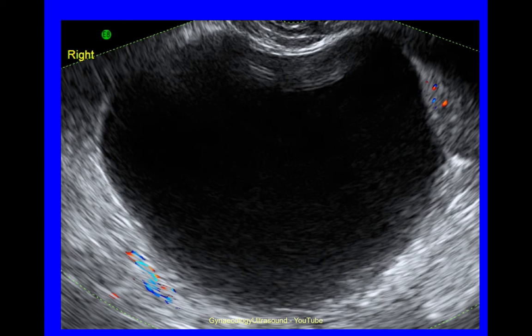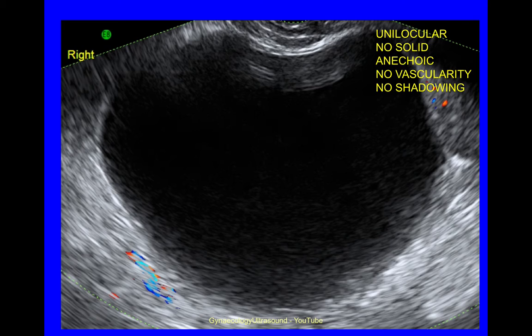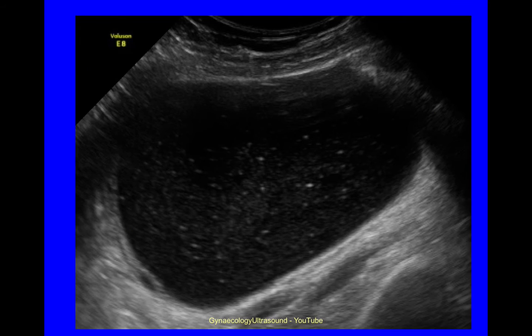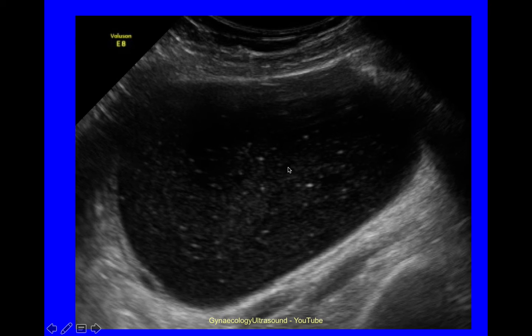Another large cyst at 105mm — unilocular, no solid material, anechoic cyst contents, no vascularity and no shadowing. This next cyst is also unilocular, no solid material, low level echogenicity, and no shadowing. Vascularity cannot be commented on as there is no Doppler turned on in this image.